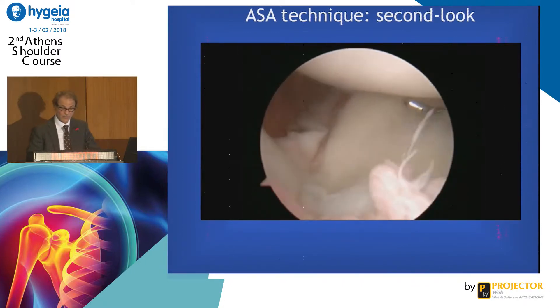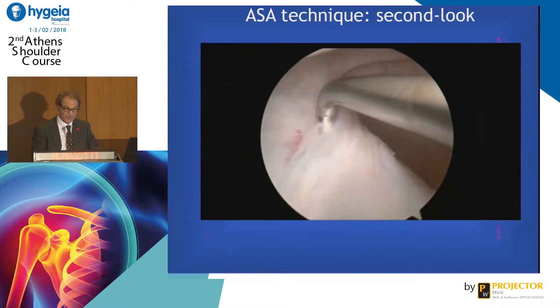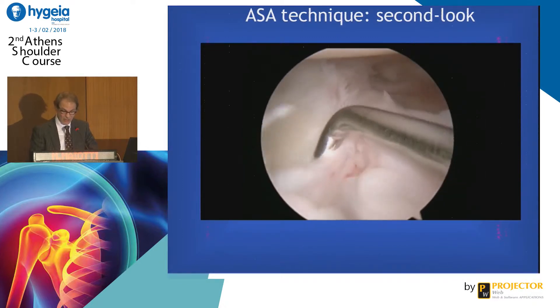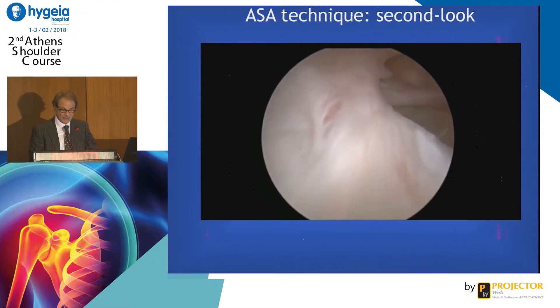You can see the labrum was completely restored. The humeral head was re-centered. You see very strong labrum, and a band of fibrous tissue going up on the north side of the joint.